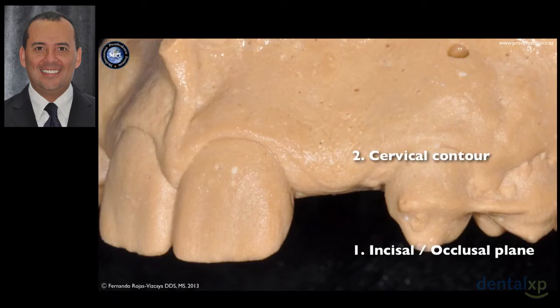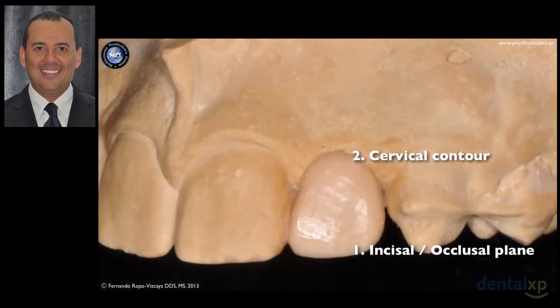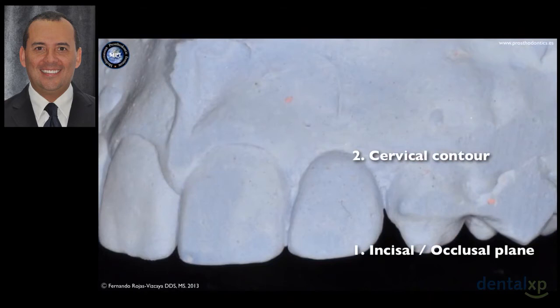You are looking here for the balance of the gingival level, so you want this margin of the crown a little bit below the line that runs from the central to canine, around 1 mm. So you fix this margin of your crown.